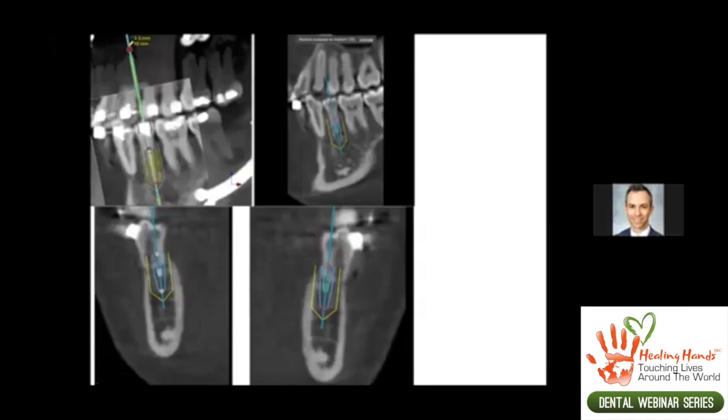So here's a patient who was referred to me for removal and placement of an implant at a premolar site in the left mandible. This was just in front of the first molar, tooth number 20 in the American nomenclature, but basically the second premolar. Looking at the planning here with 3D imaging, we could see that there's root resorption, and we can also see that there's been some loss of the buccal plate. So there's a lack of buccal plate. In those situations, I don't like to place an implant if there's no buccal plate in place, if you're considering an immediate implant placement.